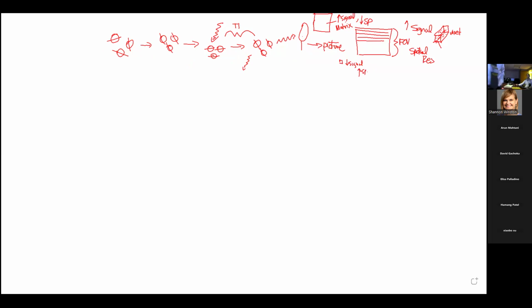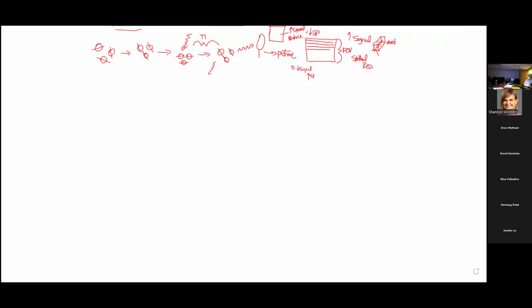Then after that, we talked about how we've got to get temporal resolution. Remember this guy?